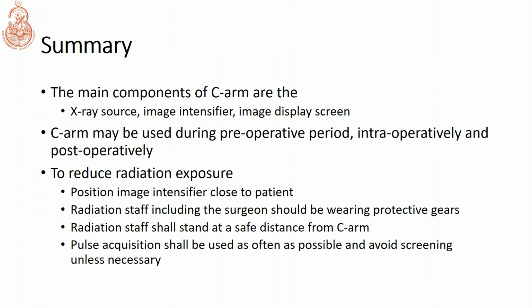The radiation staff shall always stand at a safe distance from the C-arm, so that as the distance increases, fewer and less intense X-ray photons will be hitting us. Next is to use the pulse acquisition technique as often as possible, and avoid screening unless it is necessary.